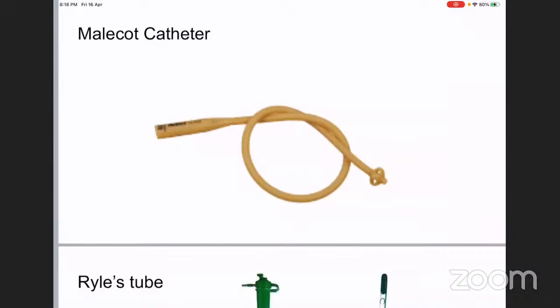It is generally used for suprapubic cystostomy. Once you perform a suprapubic cystostomy, you can place a Malecot's catheter to drain the bladder. It can also be placed inside abscess cavities to continually drain a residual abscess. So always remember, you never place the Malecot's catheter perurethally. It can also be used instead of an abdominal drain.